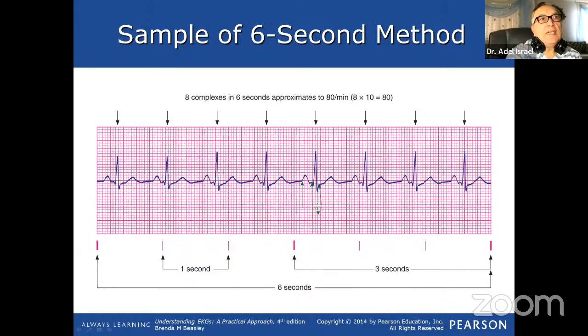The conclusion is you can say for now, normal EKG. And in chapter 7 we are going to learn the name for a normal EKG: it will be sinus rhythm. We will touch on this in chapter 7. But so far, this is a very good example for every one of you to train yourself how to go through it like I did with the 5 steps.